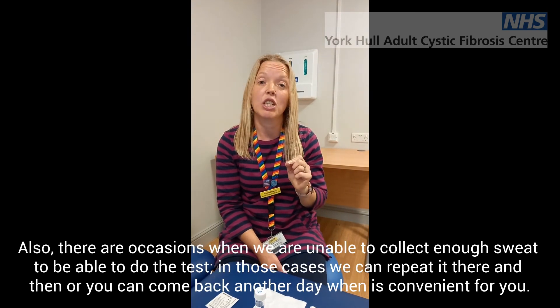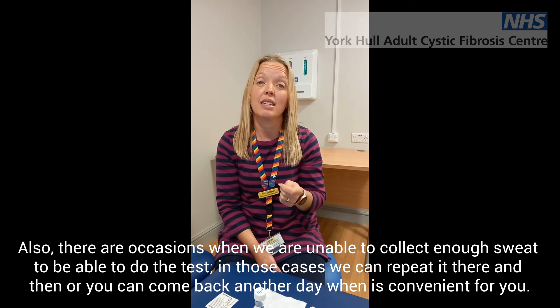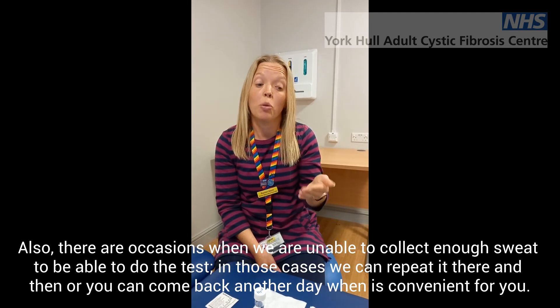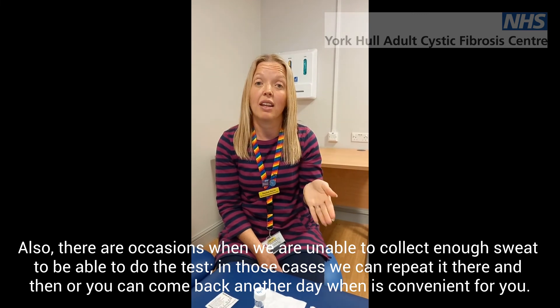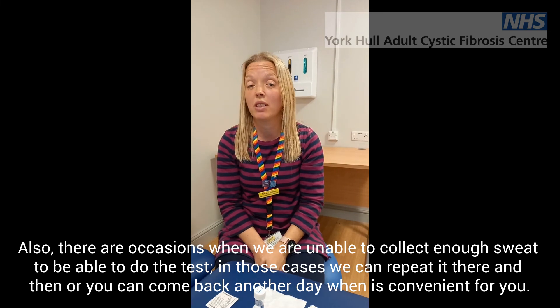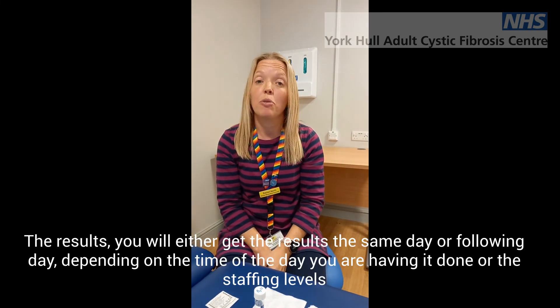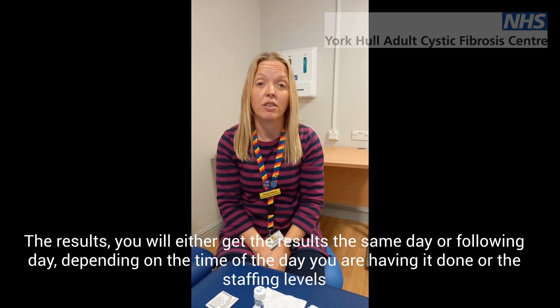Also on the day, if we don't collect enough sweat to be able to do the test, we normally know then and there that there's not enough. We could either ask if you wanted to have it done again then and there, or book you to come back another day, whichever is most convenient for you. You'll either get the results the same day or the following day, depending on the time of day you had it done and the staffing levels.